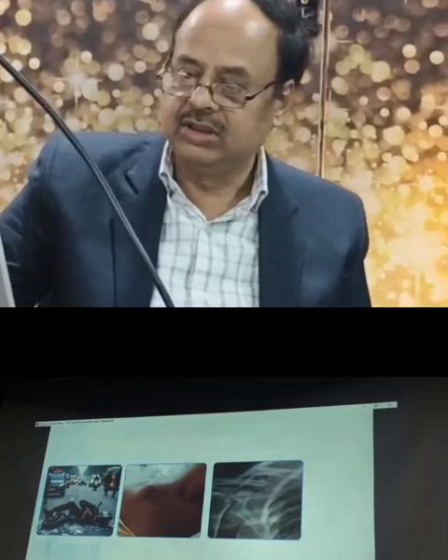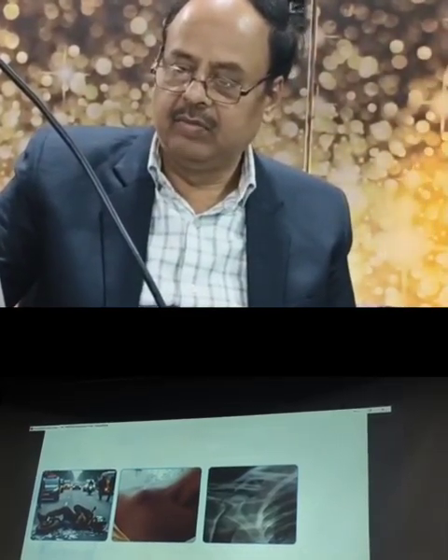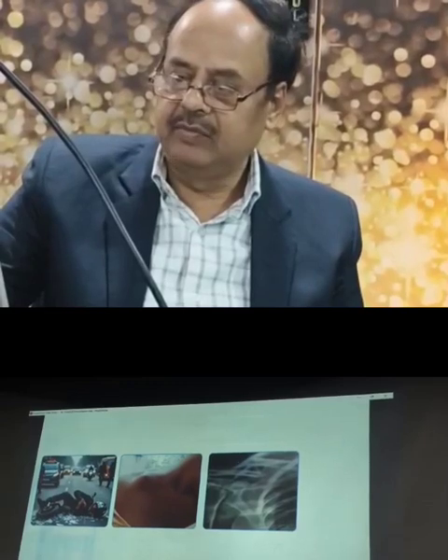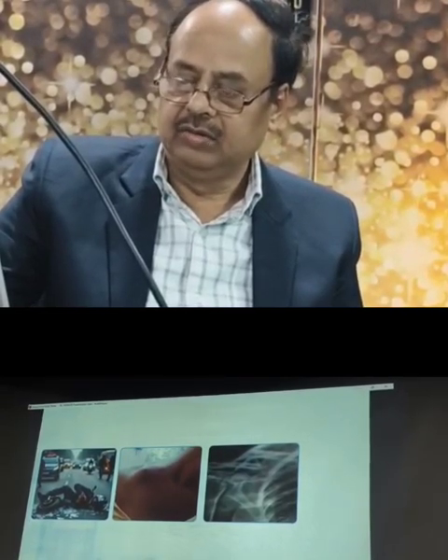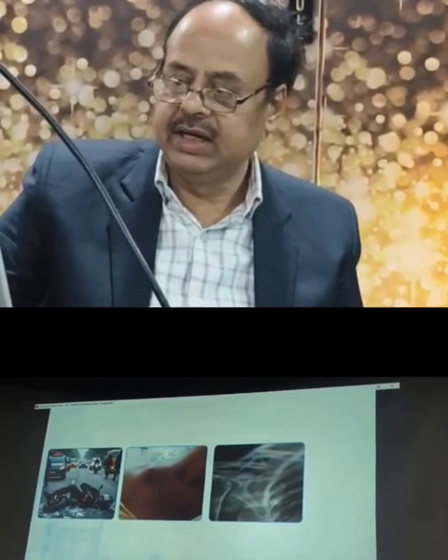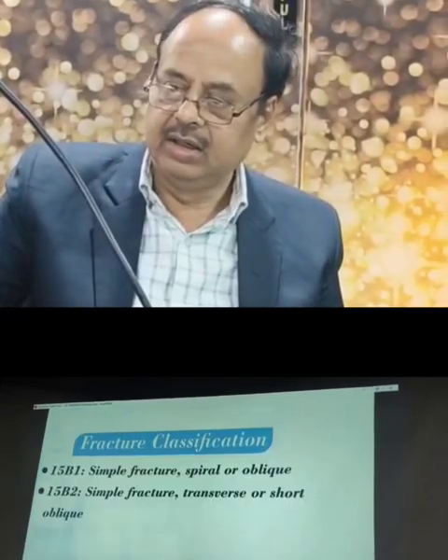And this is the typical radiological picture. You can see the severely displaced fracture, more than 2.5 centimeters, a Z type of comminuted fracture, and the other indication for surgical treatment is the floating shoulder. So these are the typical presentation, the radiological presentation, and the mode of injury.